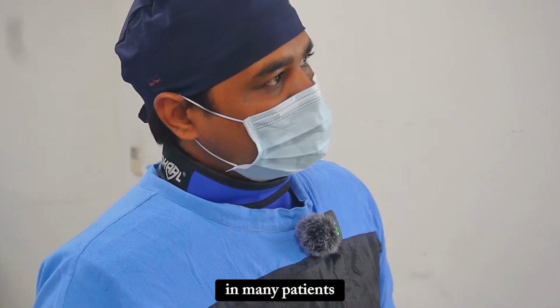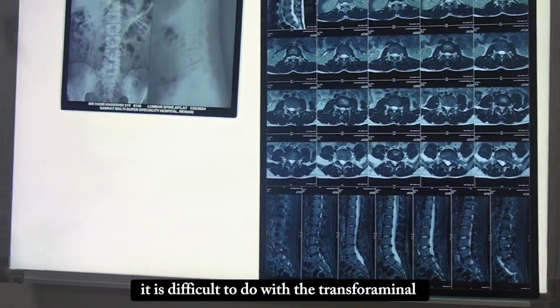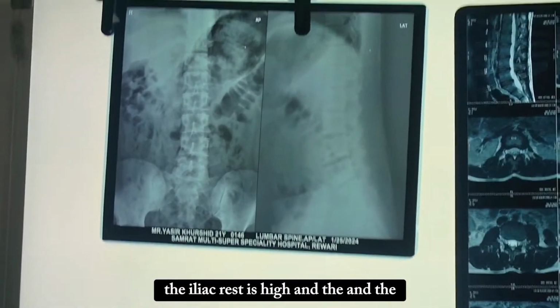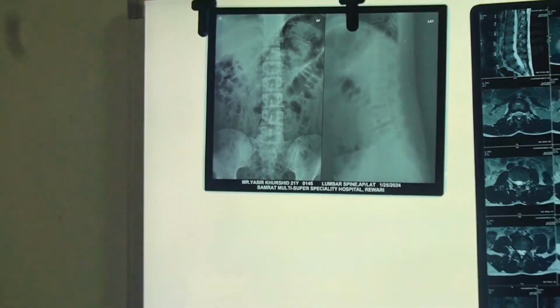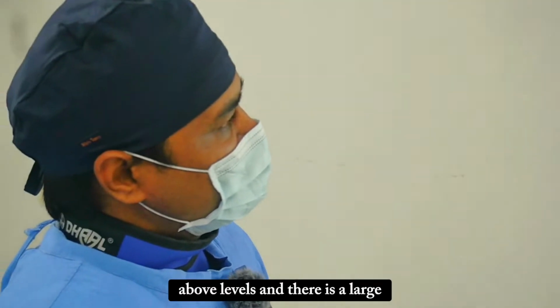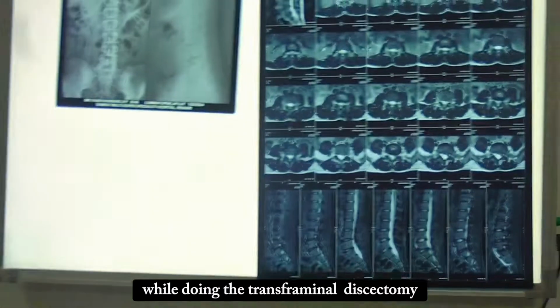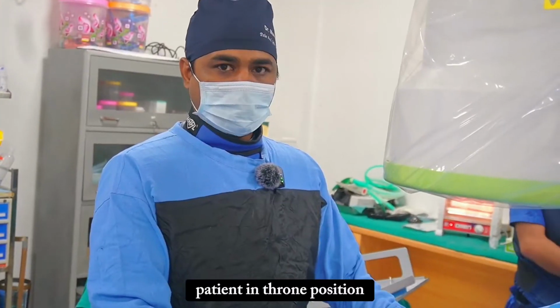In many patients, if there is an L5S1 level disc prolapse, it is difficult to do transforaminal endoscopic discectomy because there are many factors. A few of them are that the iliac crest is high, the aperture of the transforaminal foramen is smaller compared to the above levels, and there is a large transverse process. So these are the factors due to which we feel difficulty while doing transforaminal discectomy at the L5S1 level. The patient is in prone position.